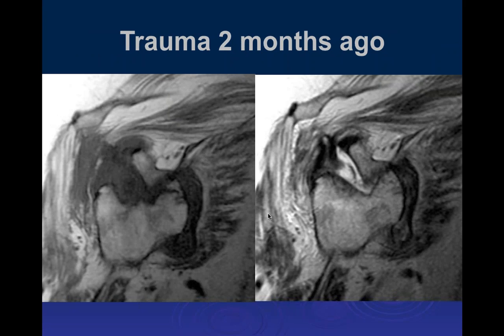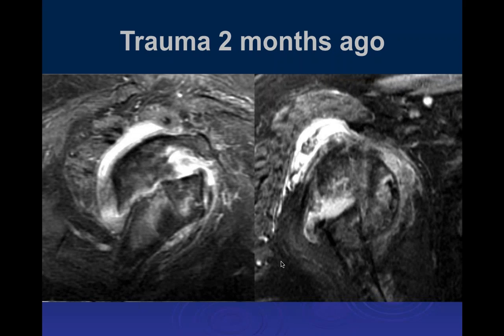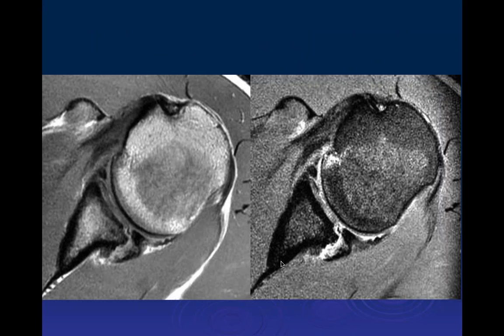And we can see extensive fatty atrophy of the muscles and hypertrophy of the subcutaneous fat here. I suspect that there was a nerve injury and loss of sensation here. Maybe. If you look at all the atrophy, including the trapezius muscle, I suspect that that's why it wasn't picked up. Yeah, that sounds good. And obviously this will need a replacement. Right.